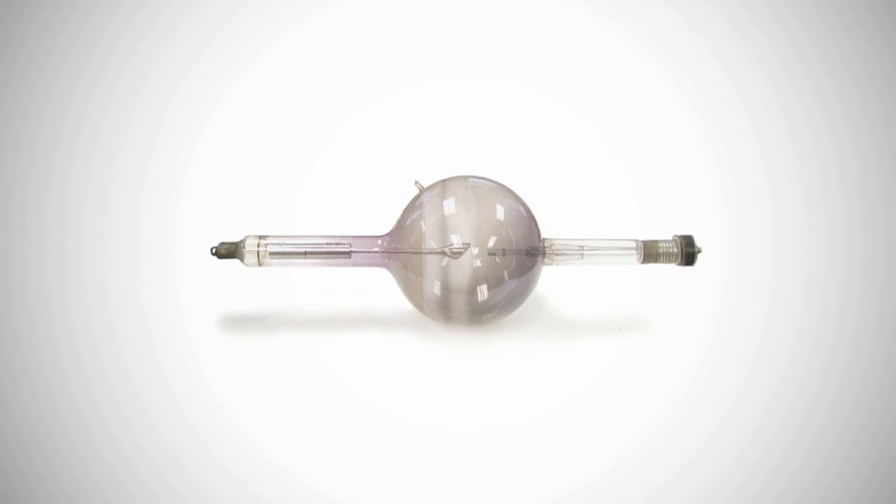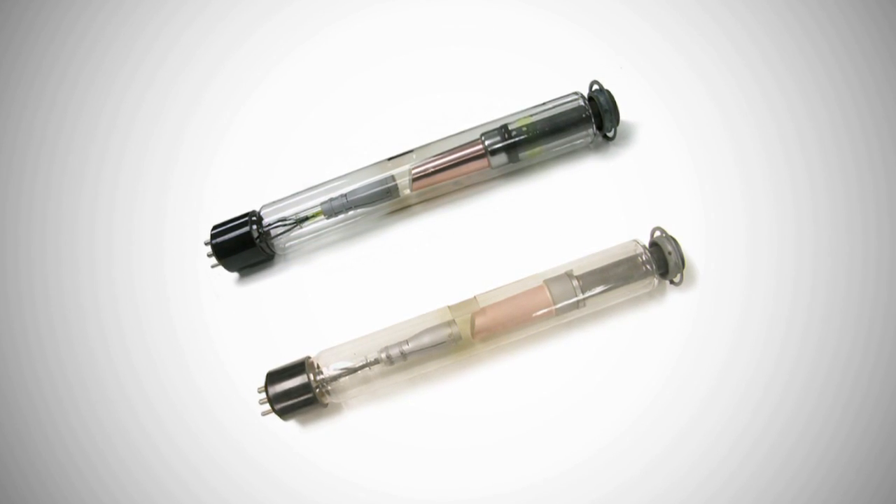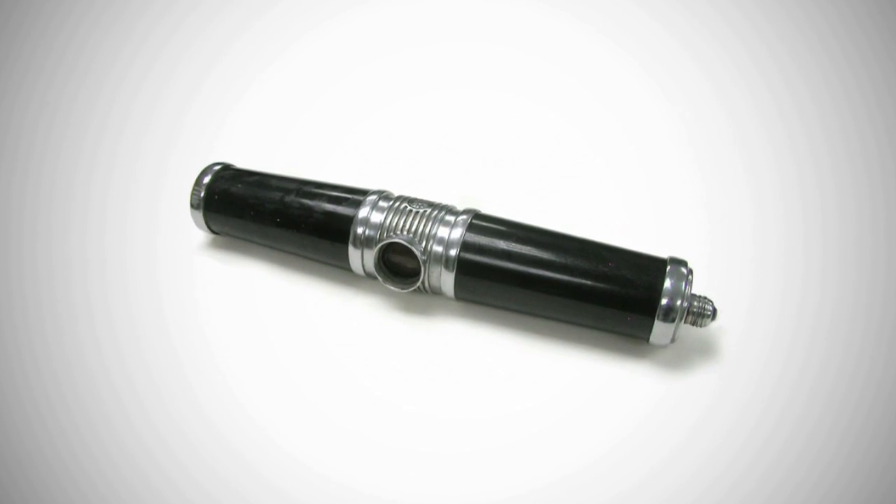Early tubes would have had a large bulb in the center. In the 1930s, bulbs were completely cylindrical.